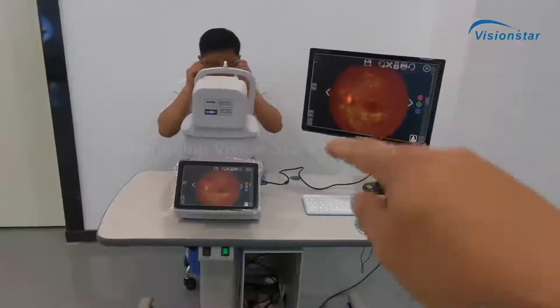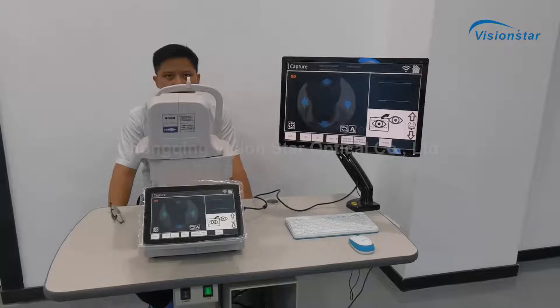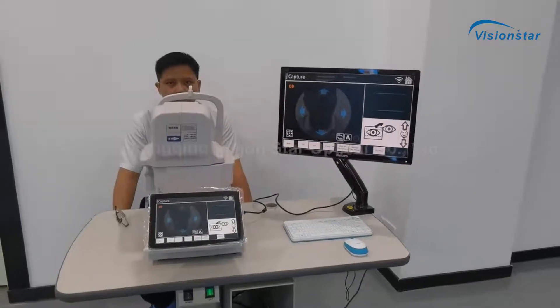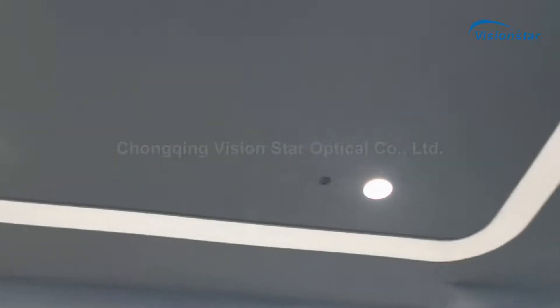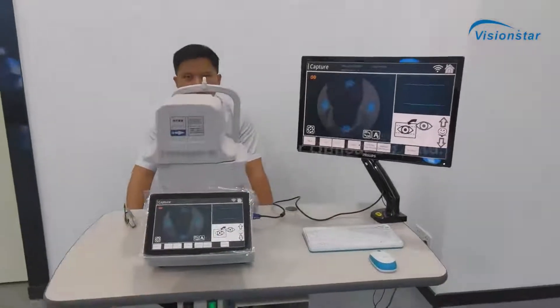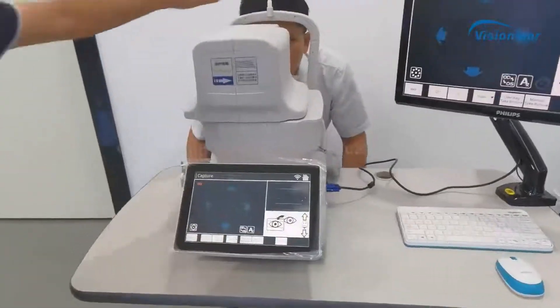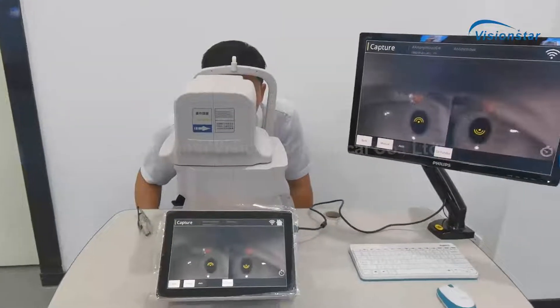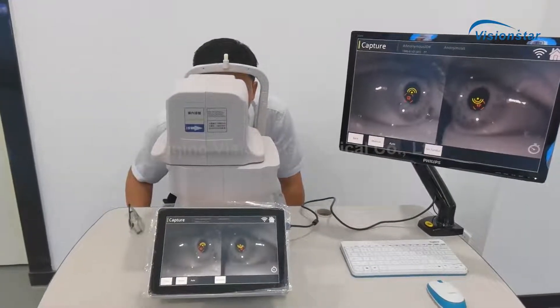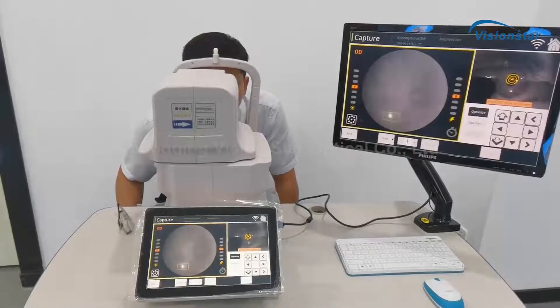Now we show you how to take photos with this machine. Normally this device should be used in a dark room — there are many lights here, but it doesn't matter for this demonstration. Put the chin at the chin rest. Just one click and it will automatically move, adjust, auto-focus, and take the image.